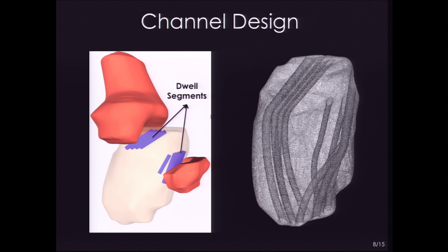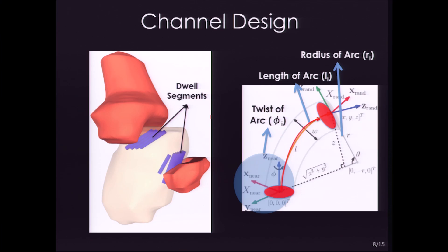A dose planning algorithm gives us these dwell positions, and channels come in because they connect these dwell positions to the entry zones. The channels are curvature constrained due to limitations on the radioactive source. Each channel is created as a sequence of arcs using traditional robot motion planning algorithms.